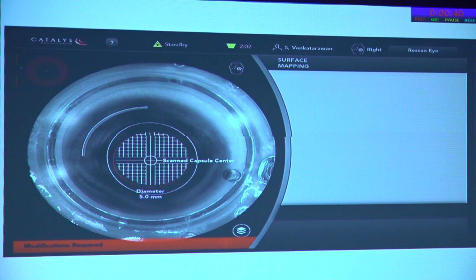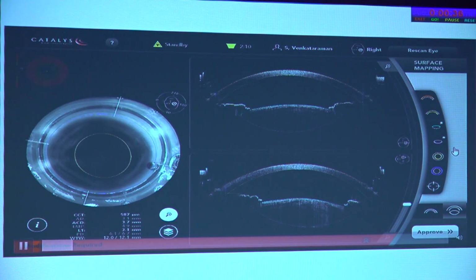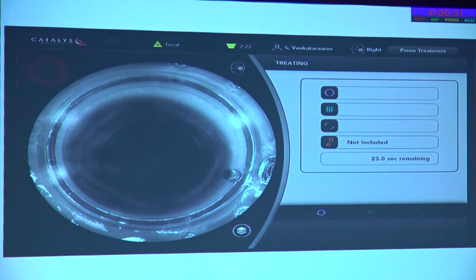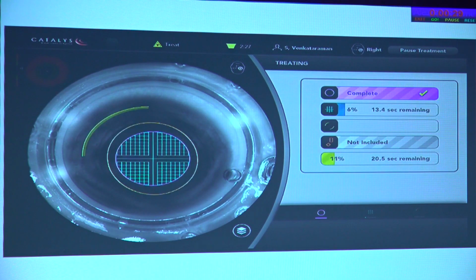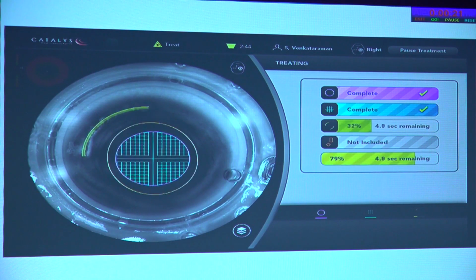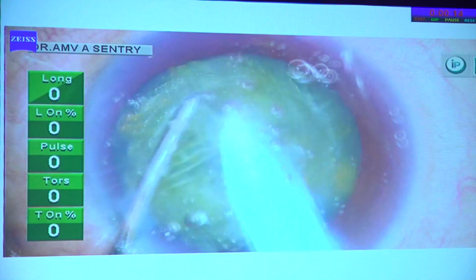So this is just a video of the scanning. You see, you have planned an LRI for this patient, and this is a scan done by the OCT. It scans the cornea, the anterior capsule, the posterior capsule, and here's the rexis being done, and here's the nuclear fragmentation. Typically, I would not advise you to use the incisions because the incisions made by the femtosecond laser are currently too corneal. They're not very limbal, so it's a little inconvenient. So we don't really use the corneal incisions per se. The rest of it is quite routine.